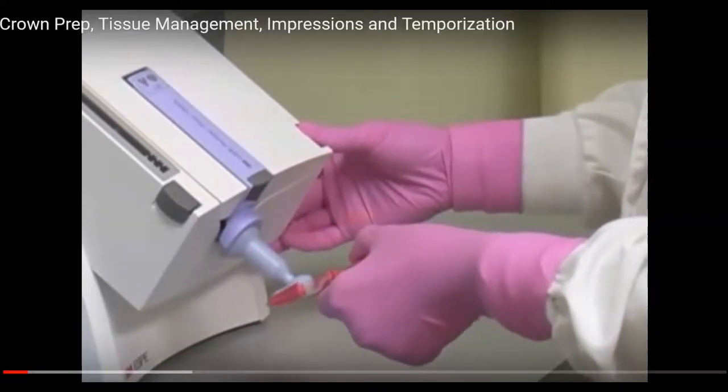So I did want to stop this video here. There's going to be a few different ways that the preliminary impression can be taken. This is a machine that can be used. What you saw in the picture prior to was the cartridge system that it uses. You load the cartridge into this machine, you press a button, and it does it all for you.